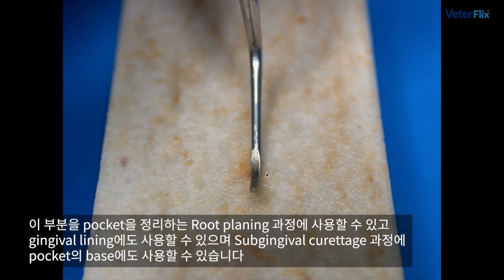That is the cutting edge, and that's to be used on the tooth root for your root planing portion of cleaning out that pocket, and it's to be used on the lining of the gingiva and the base of the pocket when you're cleaning out and doing your subgingival curettage.